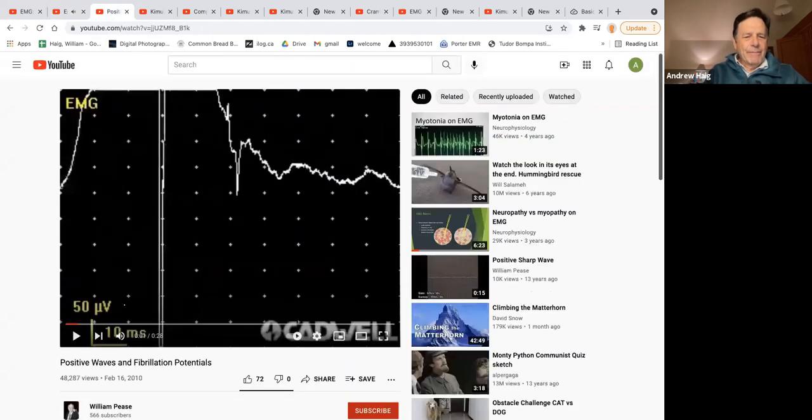This next one is positive waves and fibrillations. And by the way, Bill Pease, who's at Ohio State, our rival at Michigan, and Jun Kimura, who's in Japan and at Iowa, made a lot of these pictures that are on the web that you'll be able to access when you get to my slides. So positive waves go down and then come up in a big bump. Fibrillations go down and up kind of sharply. So here we go.